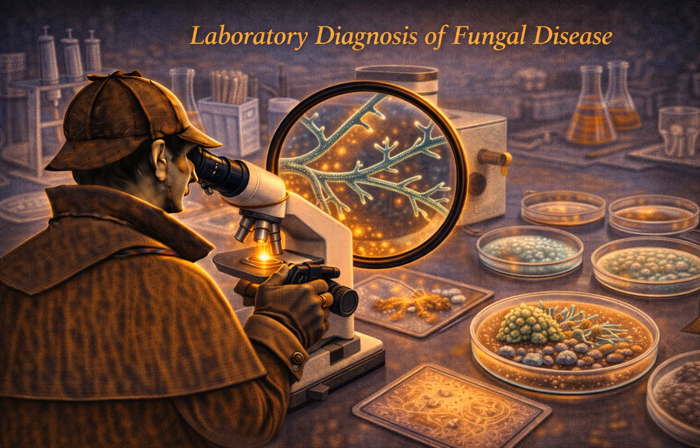Enter the weed killer: selective media. Exactly. We need to artificially suppress the competition. Step 1 is adding antibiotics to the agar. Penicillin, streptomycin, gentamicin, chloramphenicol. These effectively kill off the bacteria. That gives the fungi a fighting chance. But Murray mentions another layer of selection, cycloheximide. This seems to be a very, very important chemical for students to understand.